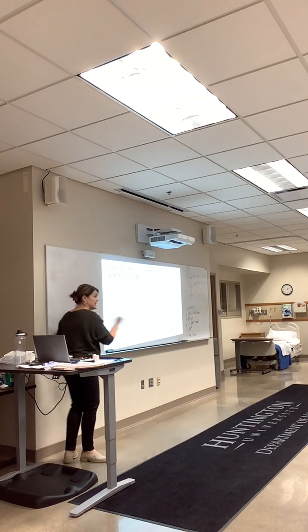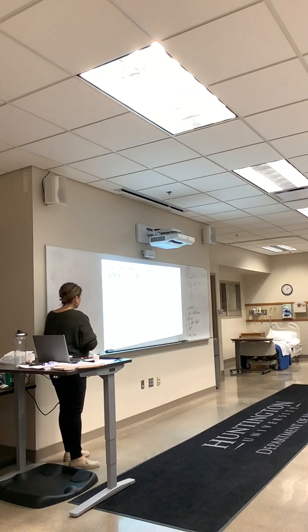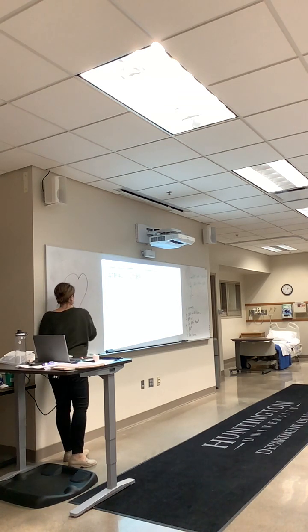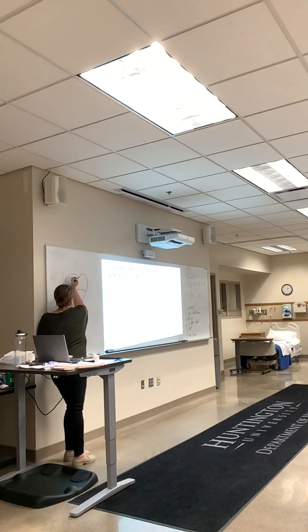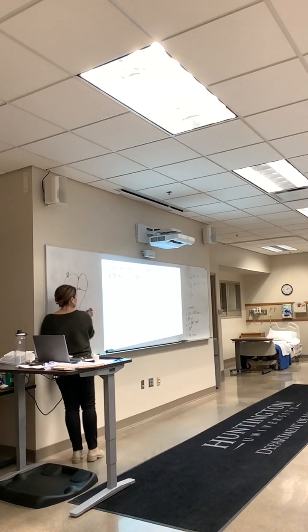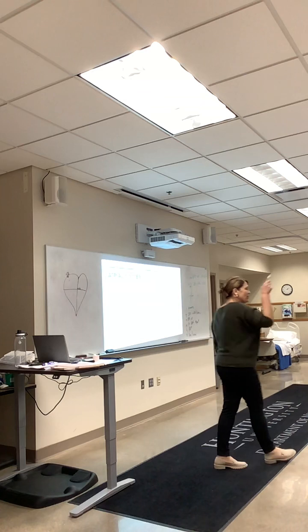Atrial flutter is very similar, going to have similar symptoms, going to have similar rates. But atrial flutter just looks a little bit different. Okay, similar thing happening. Okay, SA node, AV node. This is coming from not the AV node. I mean, it's not from the SA node, it's coming somewhere else. And so usually, they look kind of consistent. Usually in atrial flutter, my P waves look the same.